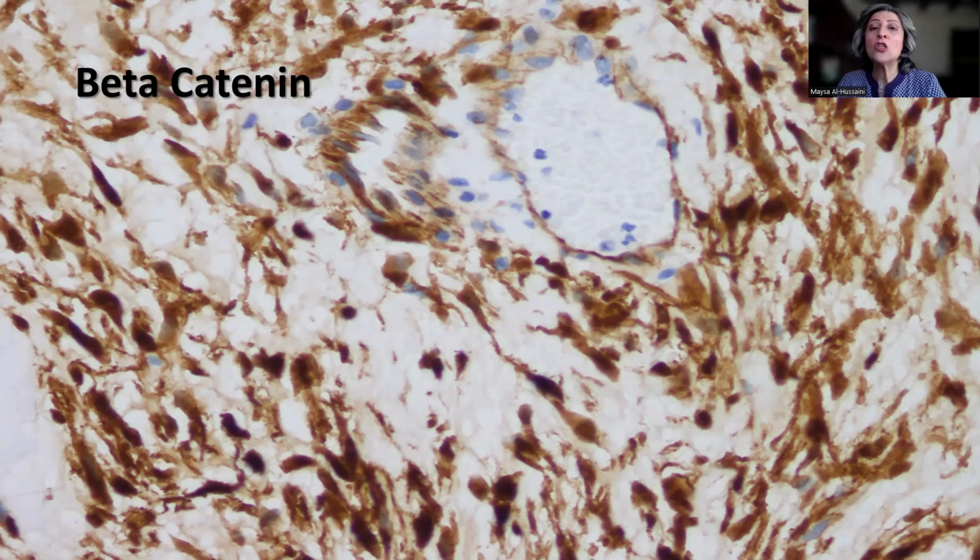I know this is difficult because usually the cytoplasmic and membranous positivity might make interpreting nuclear stain really difficult. So first of all, the way we interpret it, we have to look for vessels and lymphocytes in which we know that the nuclei will be negative. And the negative nuclear stain with beta-catenin would stain blue. This is the hematoxylin, the background stain that we use in immunohistochemistry. So we know that our stain is working properly and is not just overstaining everything on the slide. So, a negative internal control.